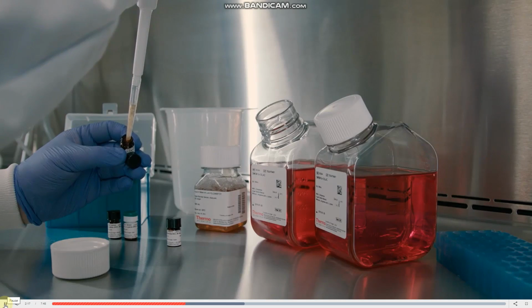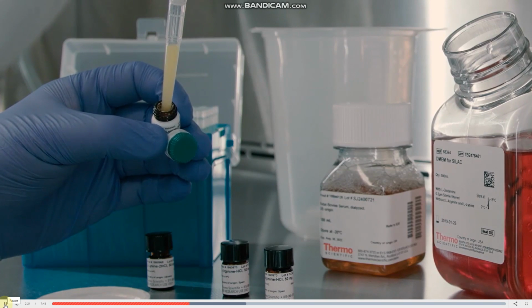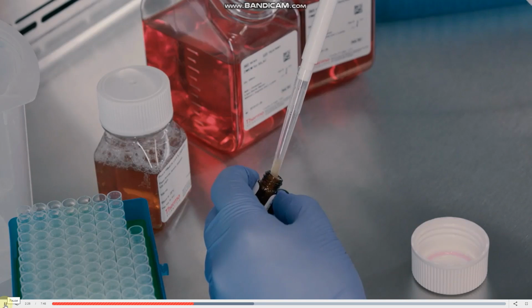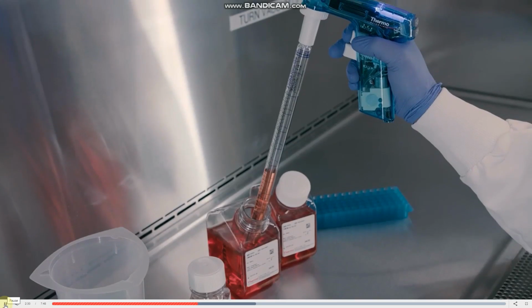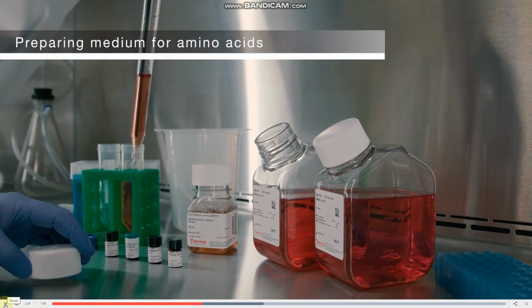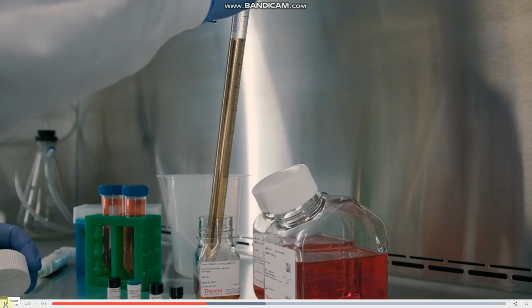The color of the medium will change from red to yellow upon addition of the amino acid hydrochloride salts. However, the color of the phenol red pH indicator will revert back to red after addition to the rest of the medium. The next step is to prepare the medium for the addition of the amino acids. Remove 50 milliliters of the SILAC medium from each bottle and replace it with 50 milliliters of thawed dialyzed FBS.